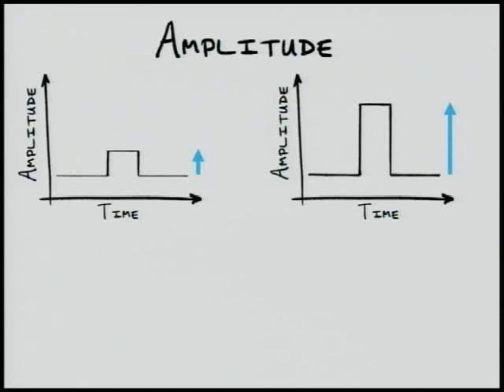Amplitude, or the strength of the stimulation waveform, is one neurostimulation parameter that can be adjusted. Generally, increasing amplitude increases nerve recruitment, or the number of nerves being stimulated. Continuing with the comparison between neurostimulation devices and pumps, increasing the amplitude is similar to increasing the rate or speed that charges are pumped out of the neurostimulation device. This also enables the charges to be pumped farther into tissues, much like increasing the flow through a garden hose enables it to be sprayed farther.